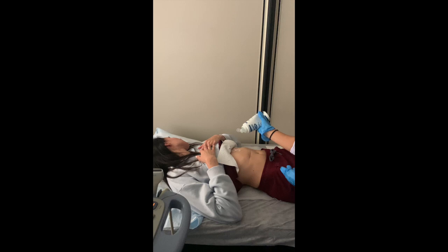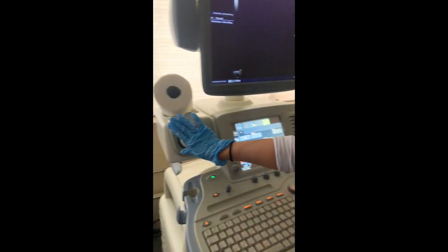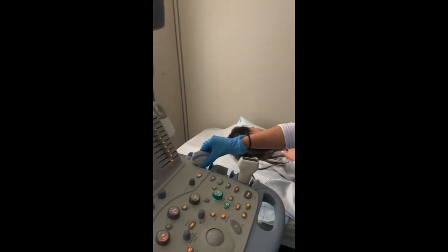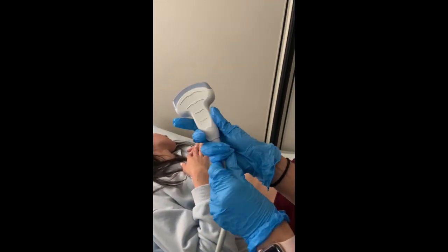For sanitary purposes, squeeze the gel directly onto the patient. Then grab the correct transducer for your exam and always locate its marker. The marker should always face you or towards your patient's head.